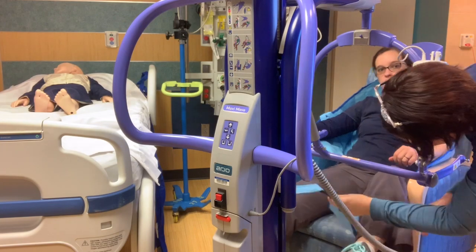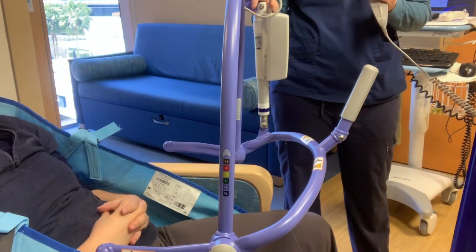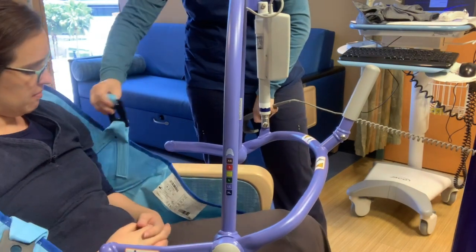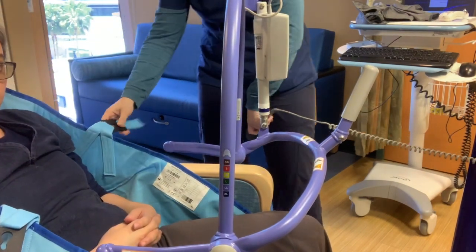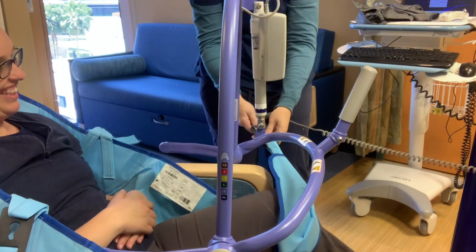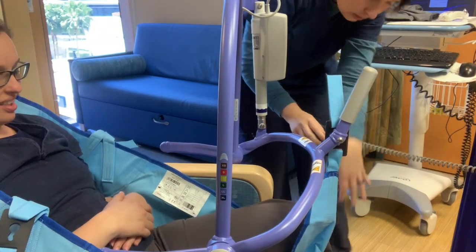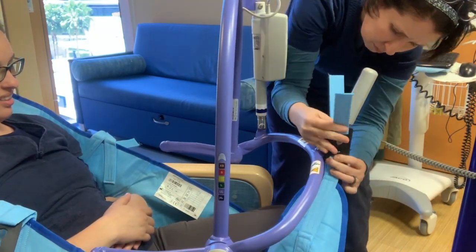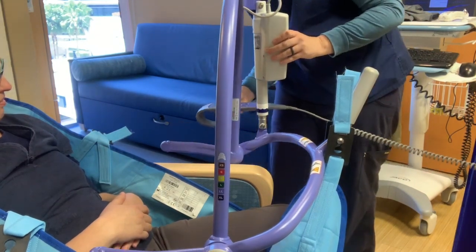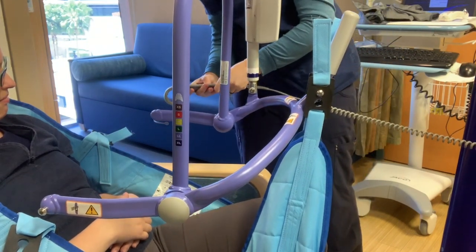First you're going to do the sling underneath their legs. Once you have the machine close enough to your patient and your patient has the sling properly positioned behind them, you're going to take these black eyelets and latch them to the machine. My patient is extra cooperative, which might not be the case. There are latches for the bottom ones that loop around the legs, and for the upper ones you can always move this up if you need to, or a little bit down to get it a little bit more towards them.